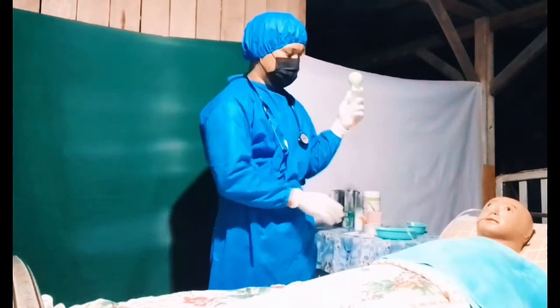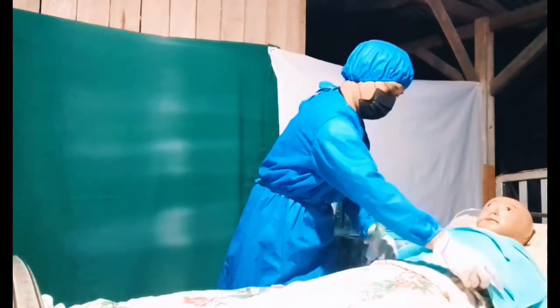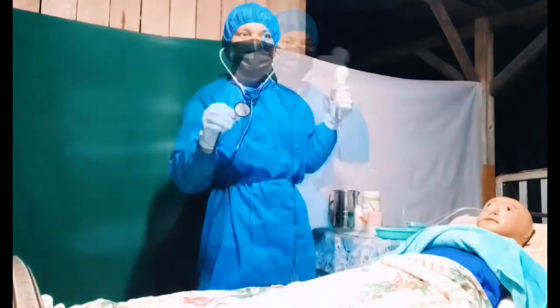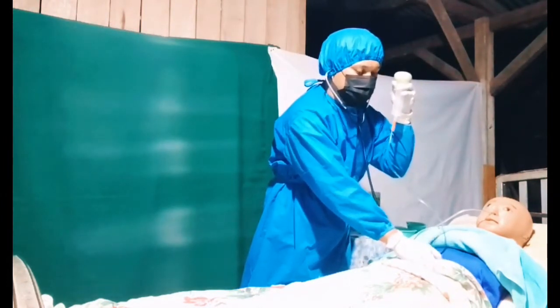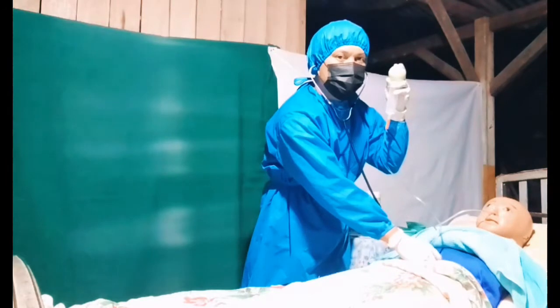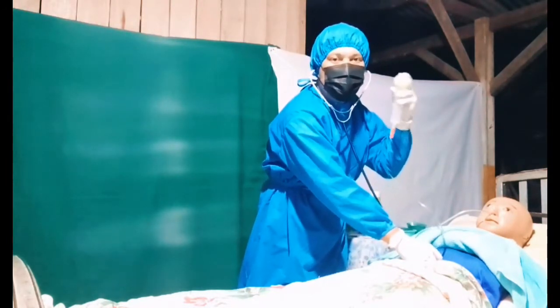That's right. Then put the stethoscope on the stomach. Introduce air. Hear a gurgling sound. If you hear that gurgling sound, that means that the tube is in the stomach.